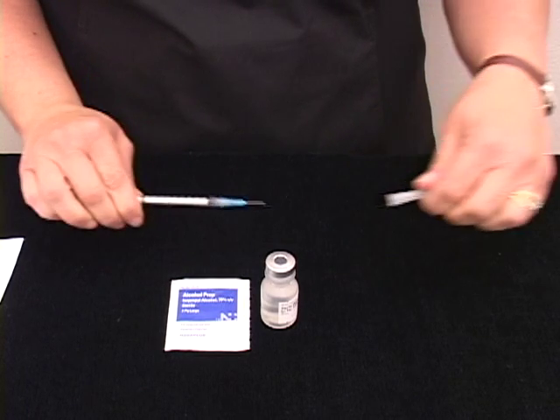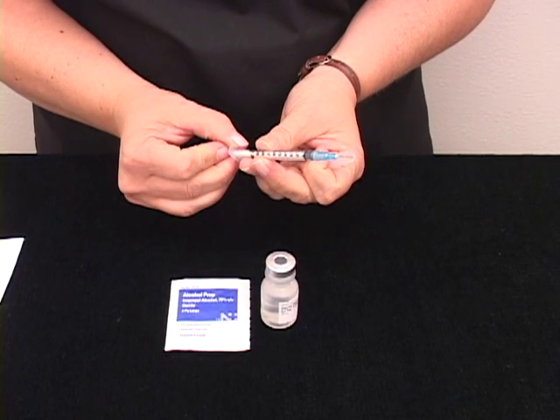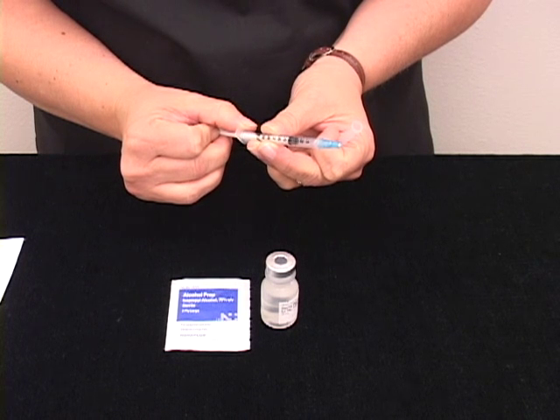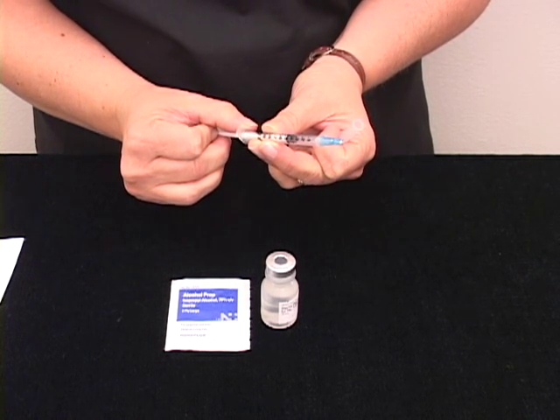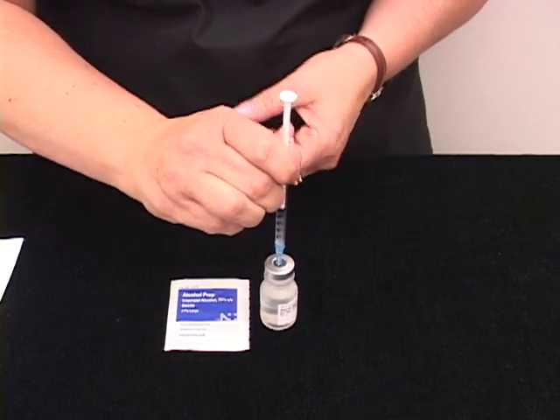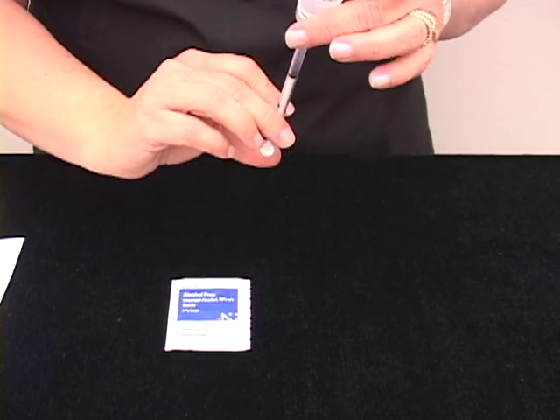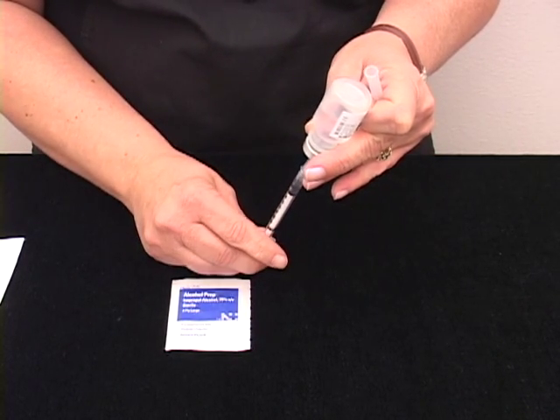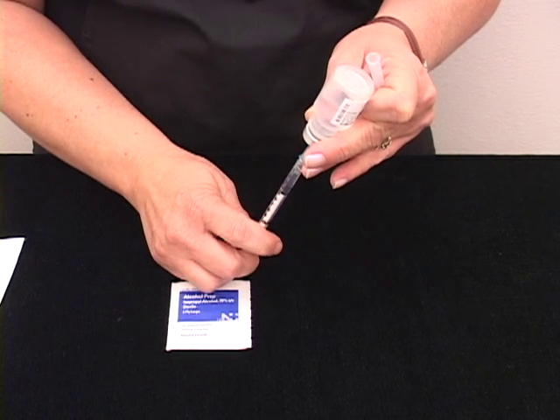Pull back on the plunger to the ordered amount, poke the needle into the rubber port on your vial, inject the air into your vial, and allow the fluid to fill your syringe. You may need to pull back on the plunger to get the ordered amount.